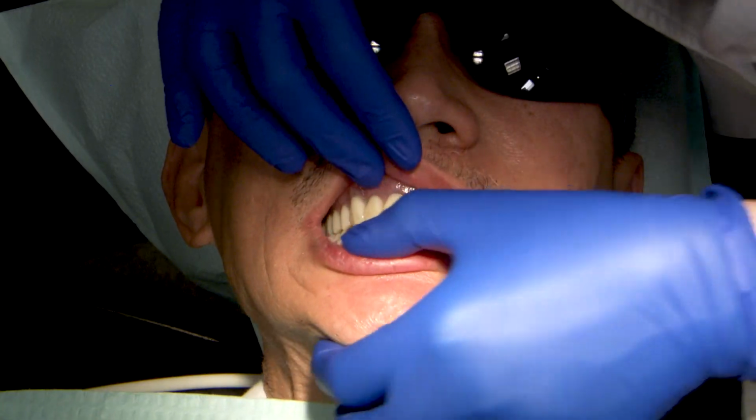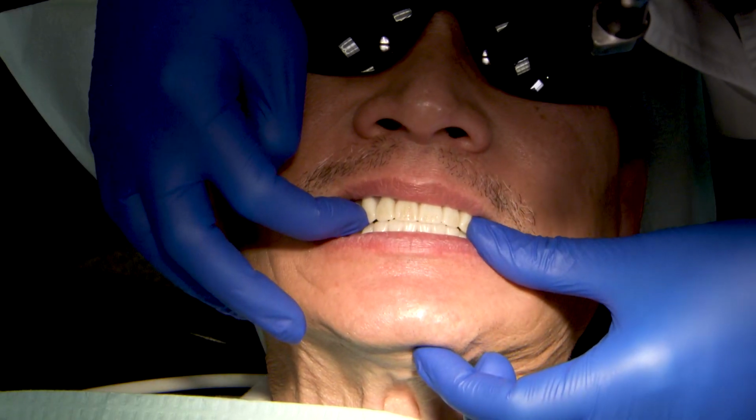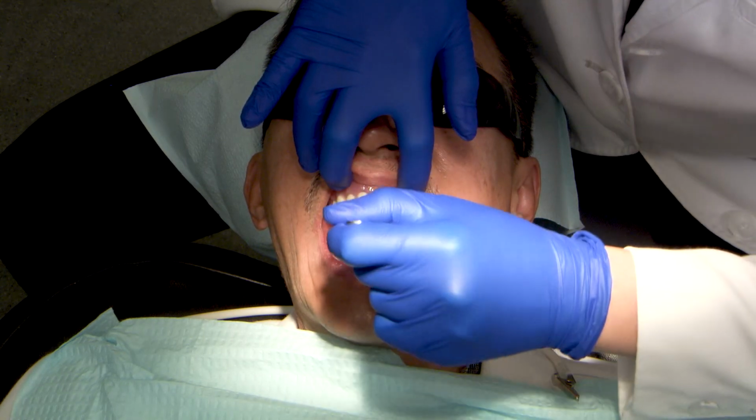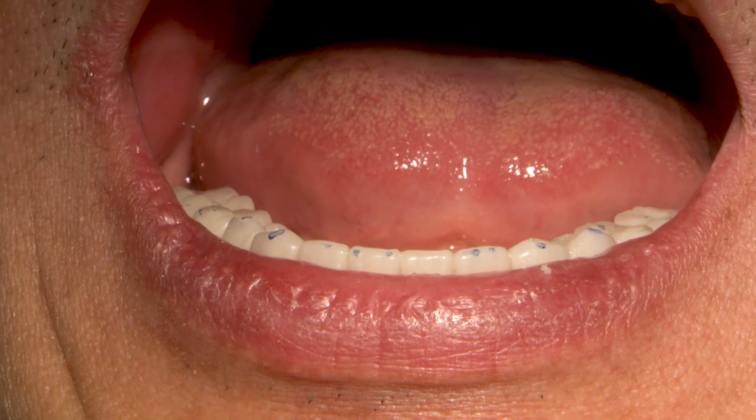As you can see here, our next visit went a lot smoother. The wax setup was inserted, centric occlusion was verified with articulating paper, and the excursive movements, the midline, and the vertical dimension were all verified and correct.